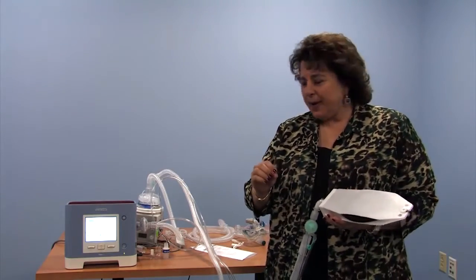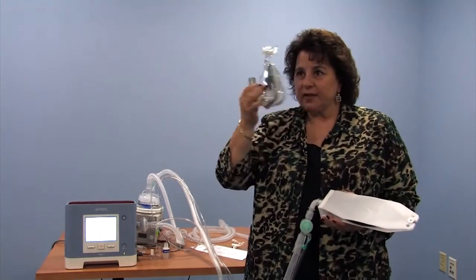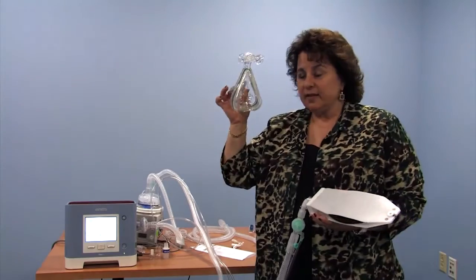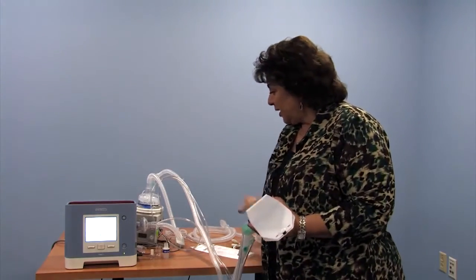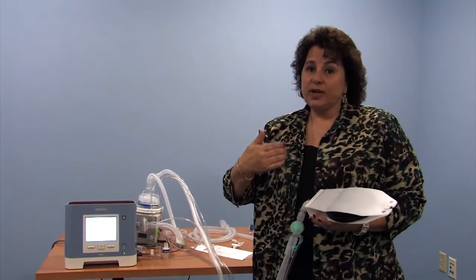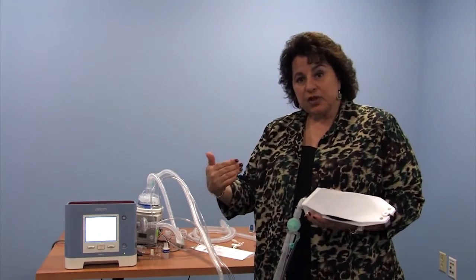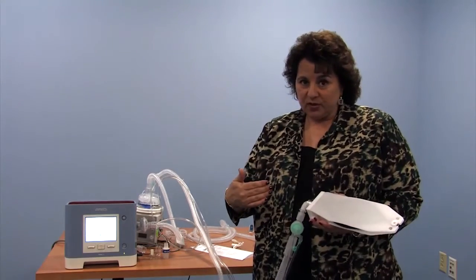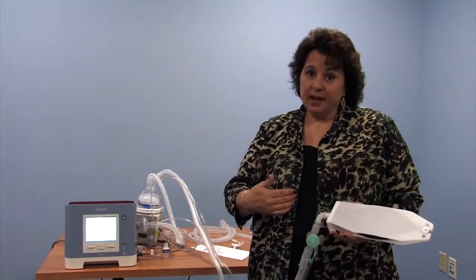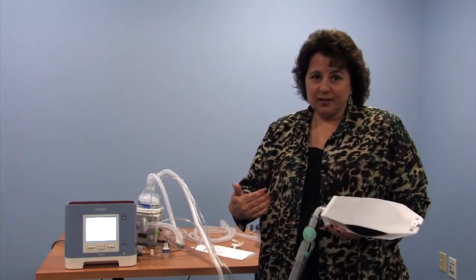Because remember, BiPAP is when you are anticipated to have a mask on your face, and the mask might move and has leaks. So BiPAP technology is made to do leak compensation. So if a patient has a tracheostomy tube without a balloon or a cuff on it, the Trilogy typically does very well with those patients. Not having a cuff is desirable by the family, and certainly the otolaryngologist caring for that child if possible.